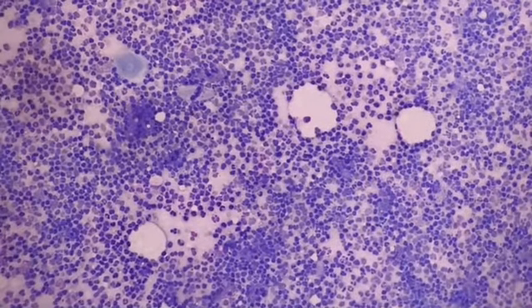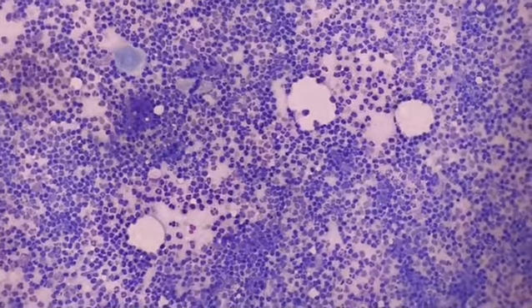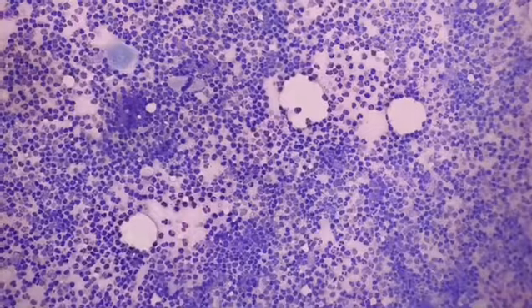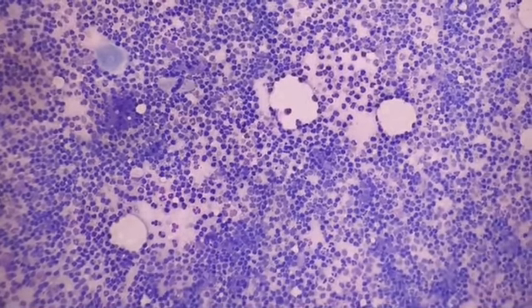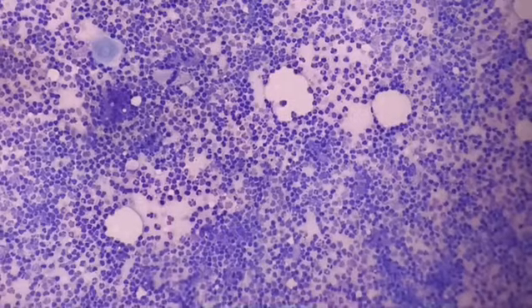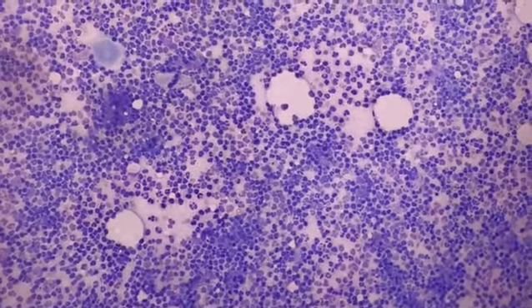So apart from making a cytological diagnosis, you need to put a note that this can be a case of inflammatory carcinoma, because we are not getting ductal cells in these smears. Dense inflammation is there. We need ductal cells showing normal morphology to say that inflammatory carcinoma breast is ruled out. But if you are not getting ductal cells, you have to put a note that a histological correlation is needed for a definitive diagnosis.